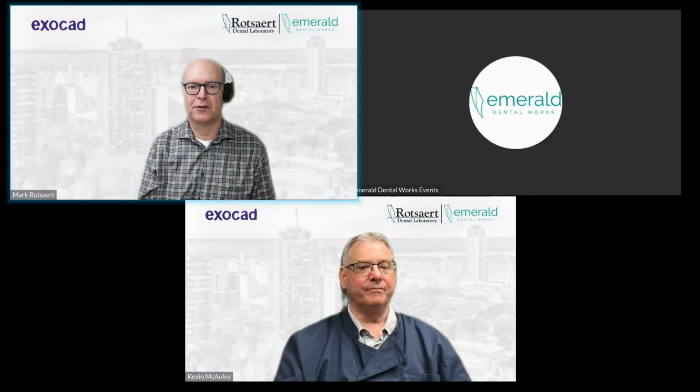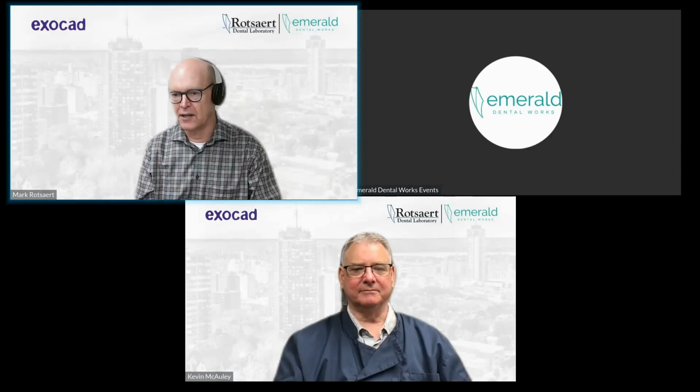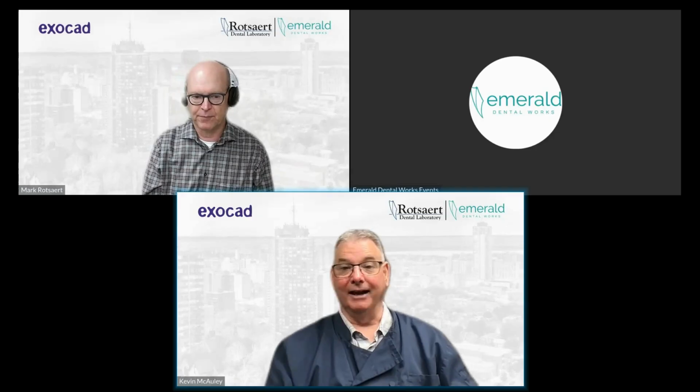Okay, next question. Oh, here's a good one that we've discussed. I think it was last week. In Exocad, are the libraries from the implant companies regularly updated? I guess they mean when an implant company updates their implant library, is it automatically done in Exocad, not in the Exocad library? Where do you find it? Yeah, good point.